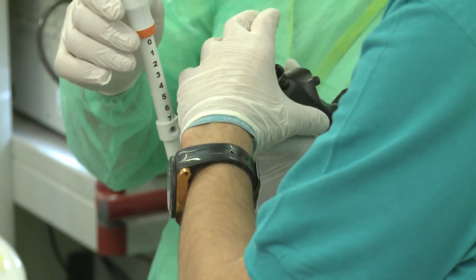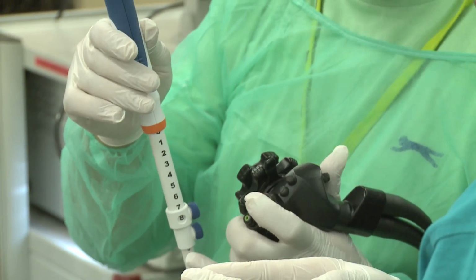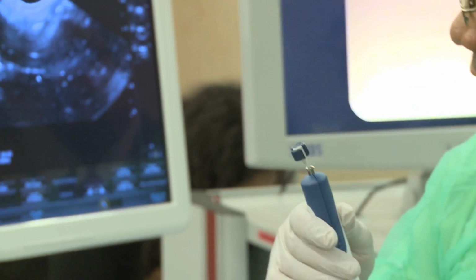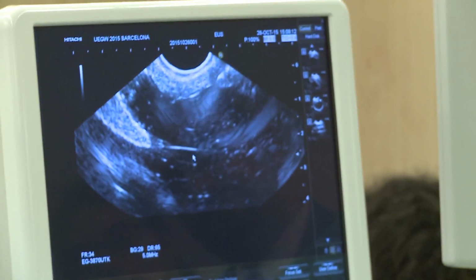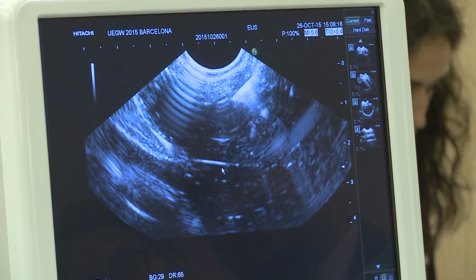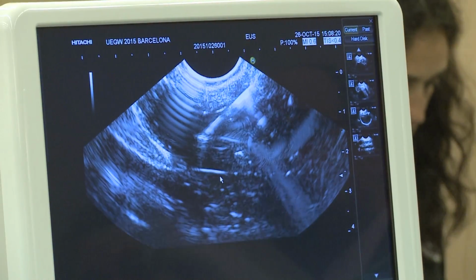Yeah, and aspirating. The problem is, if you don't aspirate, you are going to have air. Aspirate and put a little bit up. Yes. Go. Yeah, that's all. Finito. Easy.